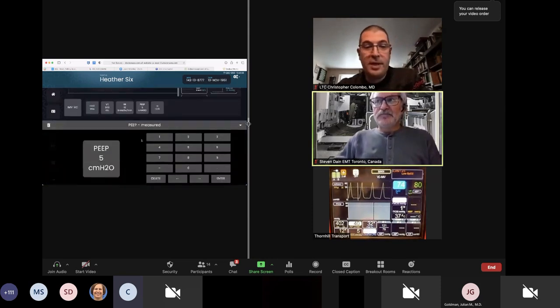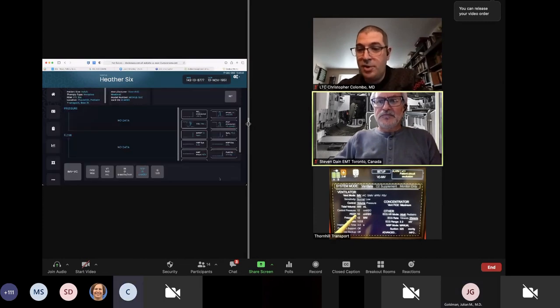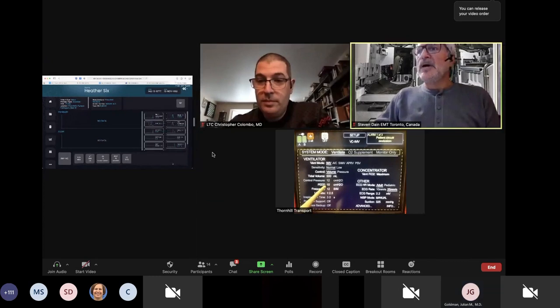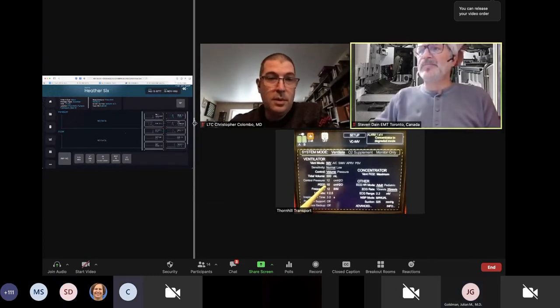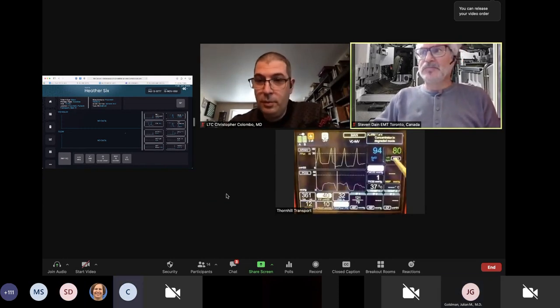I'm going to go ahead and make a second change. So I'm going to open up the positive end expiratory pressure for you. It's set at 5. I'm going to turn that up to 10 to see if we can't open up a little bit more lung. So I've made that change. Can you verify? Yes, I can see that on our monitor here. Okay, and I will stay at 10 centimeters of water with you. Excellent.